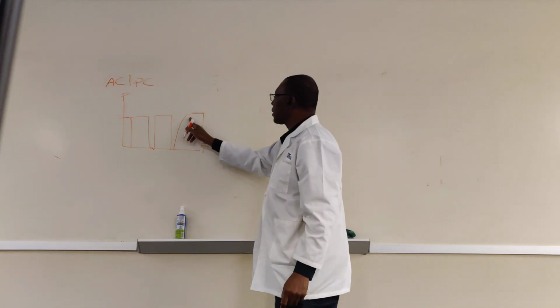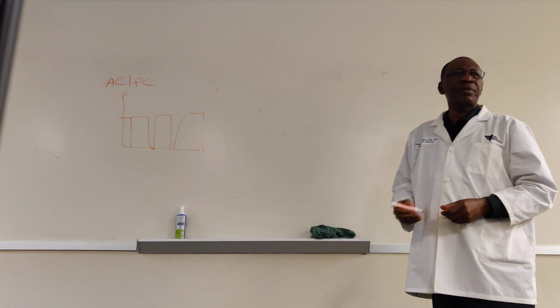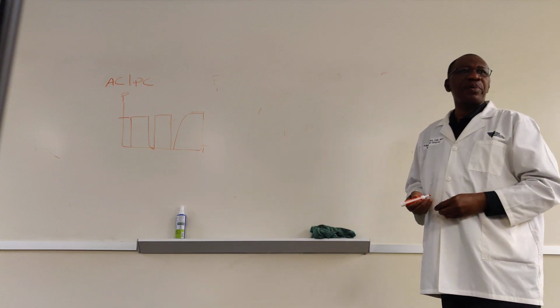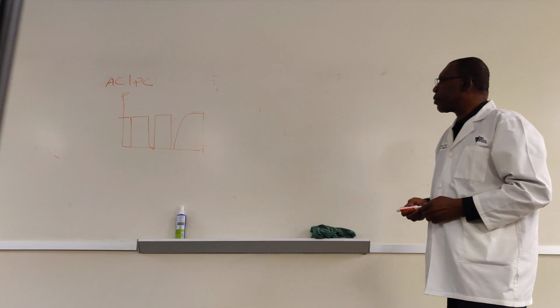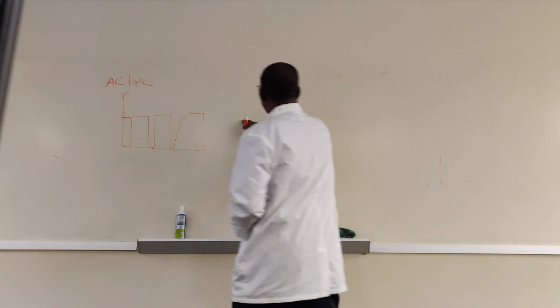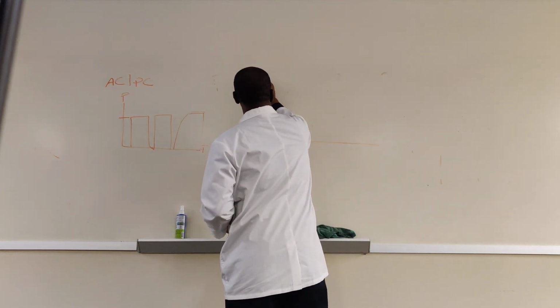Now, this is your rise time here. That's what the rise time does. It slopes the pressure. Another name for it is pressure slope. Okay, that's another name for rise time, pressure slope. And then you go to your flow time curve here.